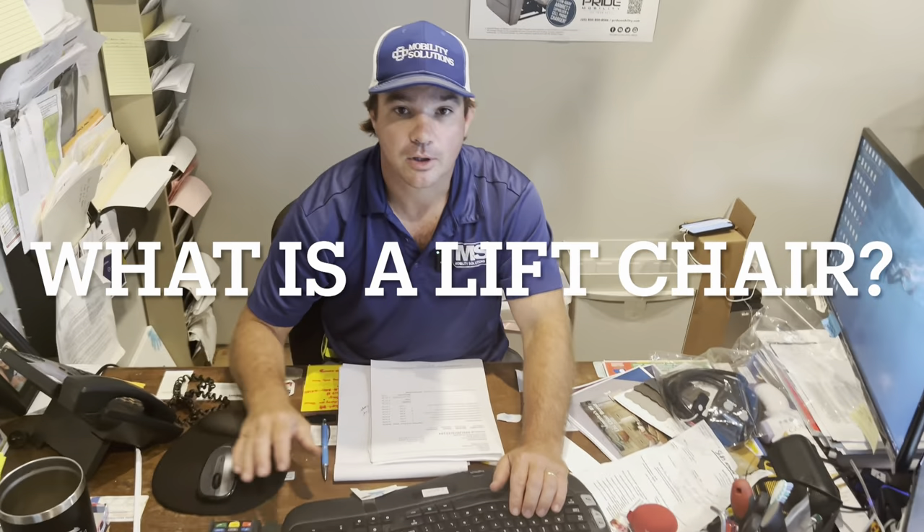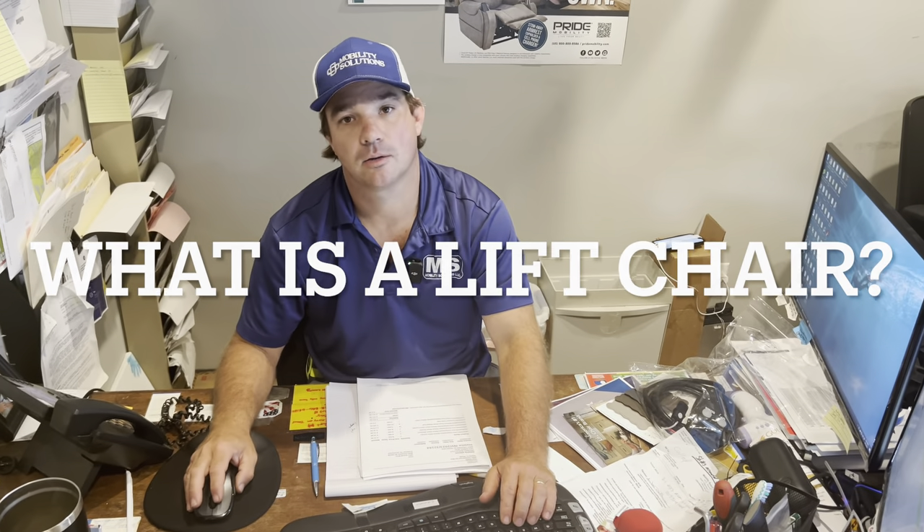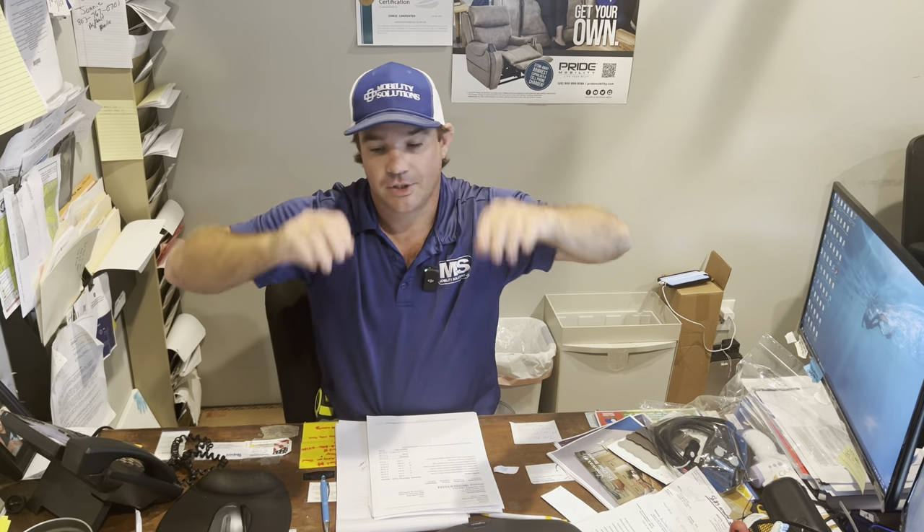Hey Chris. Hey Andre. Got a question for you. What's that? What is a lift chair? Well, I call them recliners with lift capabilities. A lift chair helps someone get up, but it can also help someone that has circulation issues, swelling in their feet, back problems, or sleeping.